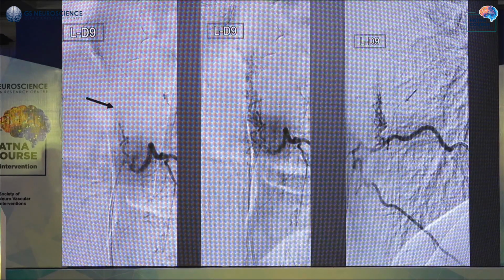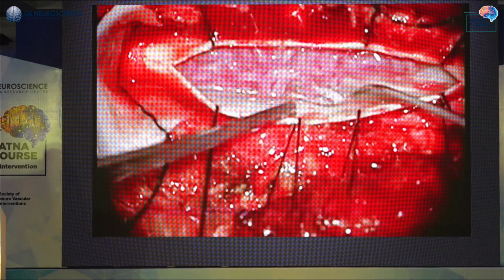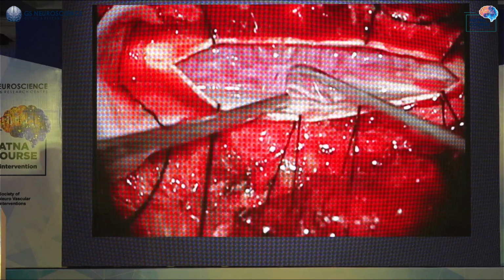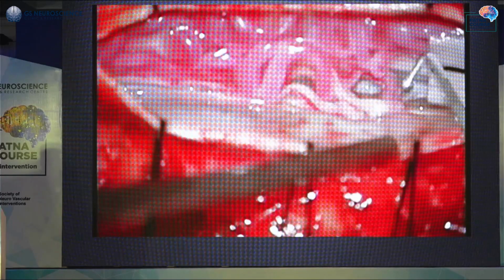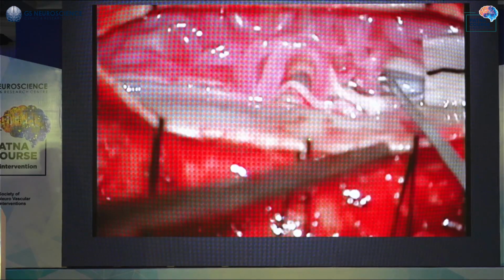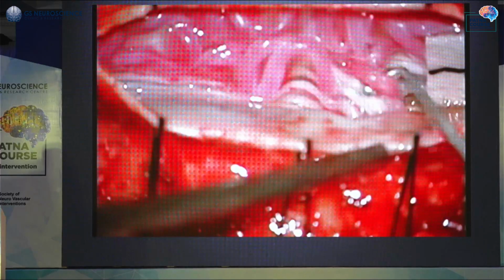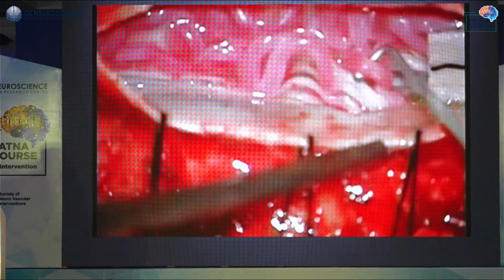I think Paritosh will talk on the surgical aspects, but I'll just show you a short video for this particular case. See, this is how the clump of veins appear during surgery. You can see the nerve root exit. You're just examining first, selecting out the arterialized vein there with the hook, taking it off. The anterior spinal artery is behind it. The artery, the radicular vessel supplying the artery of Adamkiewicz, is behind it.